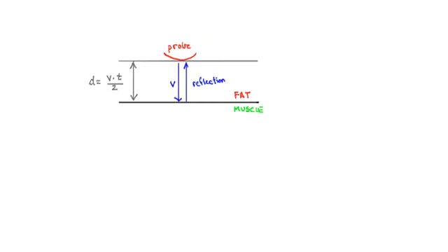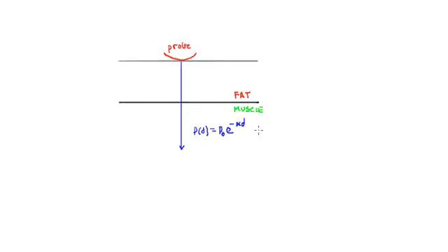Let's go back to this picture of the wave going in. You have this ultrasound wave propagating down into tissue, and as it does, it's attenuated, so the pressure differences become less and less the deeper you go. I can write an equation for that. You can imagine what it is. You start with some pressure at the top. It's e to the minus alpha d, okay? And actually, alpha depends on frequency, so we usually write this alpha of f times d.